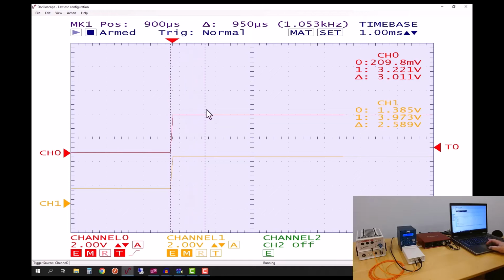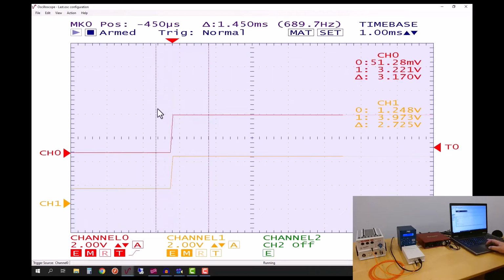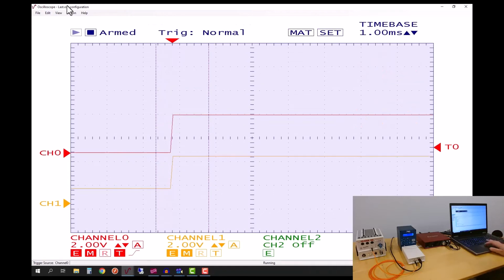You might have been paying closer attention than me, but somewhere in the range of a millisecond, maybe more than that. In some cases, the triggers from the serial port were preceding the sound. The reason for that is just a little nuance in the presentation software.